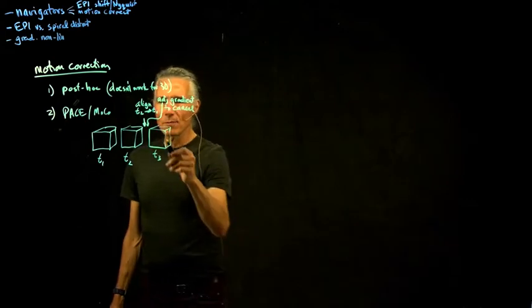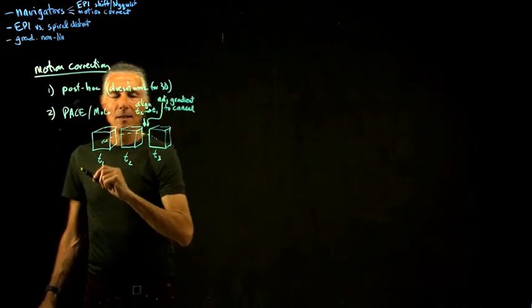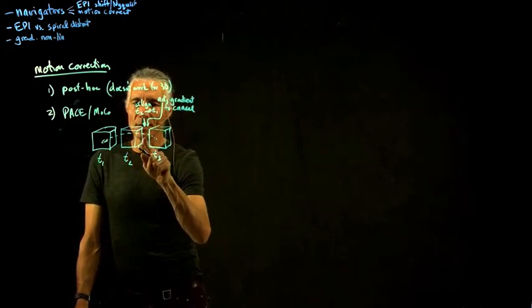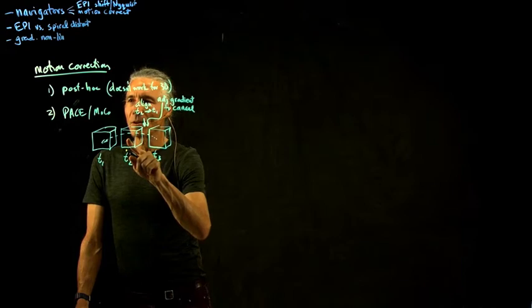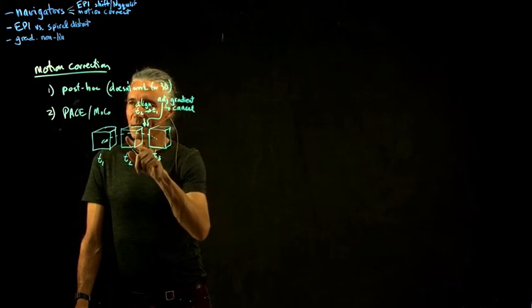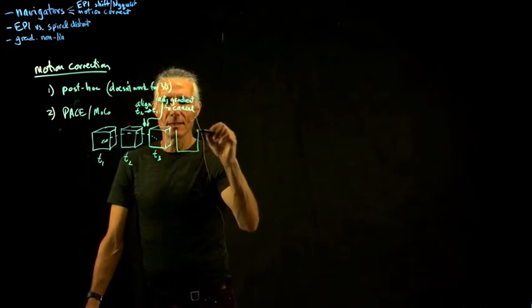So T3 will now be aligned back to T1. Now T2 clearly is screwed up because that one's not corrected, because you couldn't determine what the error was until after you collected it. And so when you're all done, you'll have to run a whole motion correction to fix the ones that were one behind.